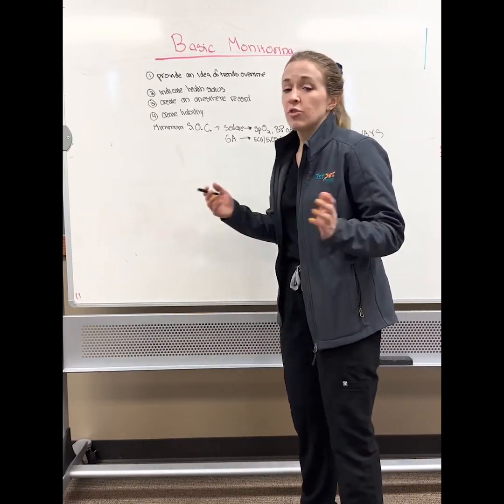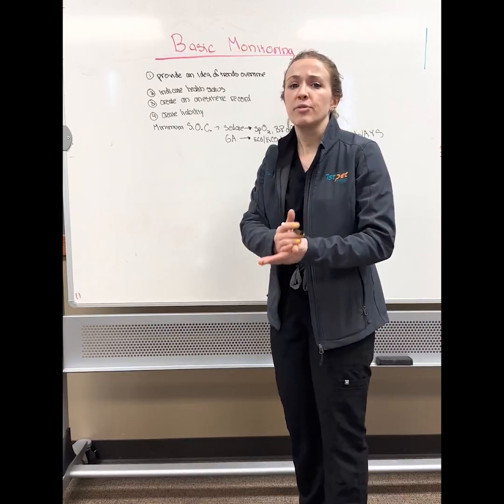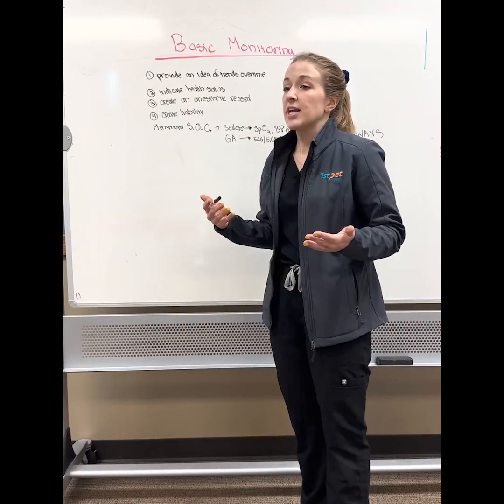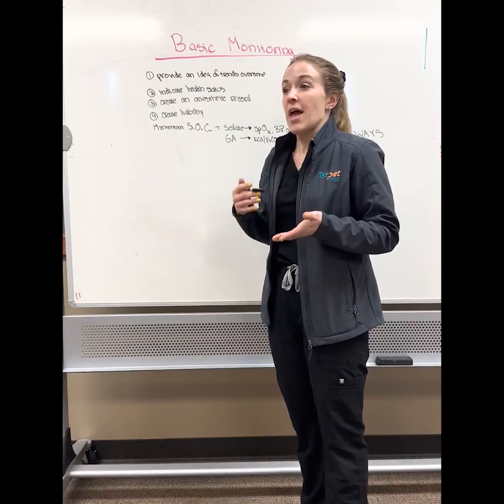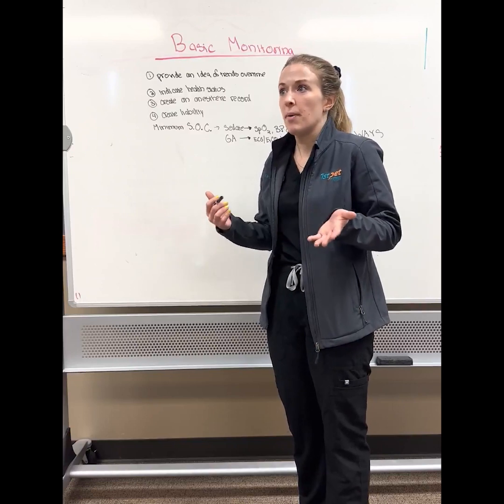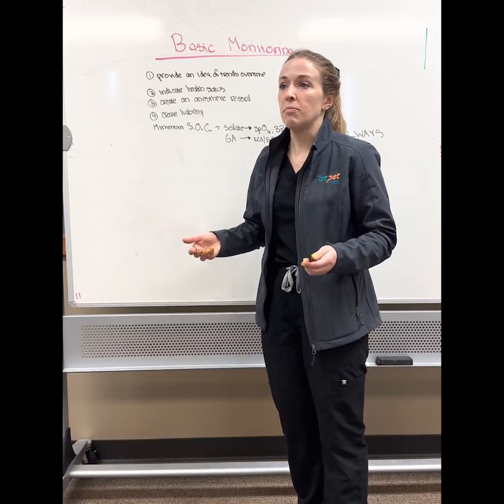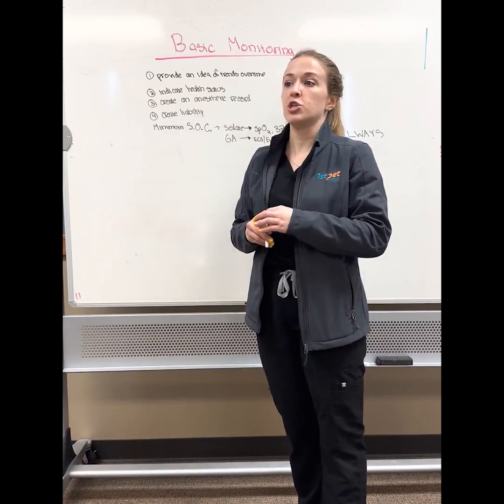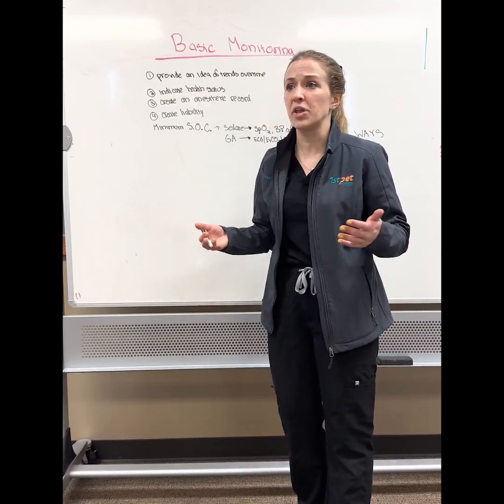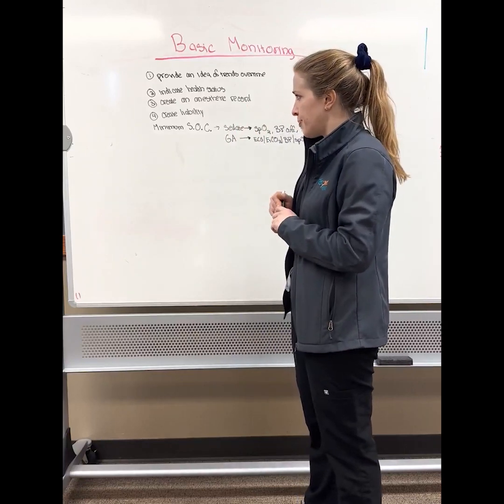Indicate health status. This is almost a given, right? By using monitoring equipment that tells you about heart rate, blood pressure, oxygen saturation, and temperature, you're going to get little peeks into your patient's health. Based on some of those parameters, you might be able to make specific diagnoses about what is going on. Did the heart rate just increase? Okay, well maybe the patient is awake, or maybe the patient is painful. Maybe it also bled a ton. Is there any blood on the floor, or is the animal really hot? These can all give you little indicators about what's going on on the inside.